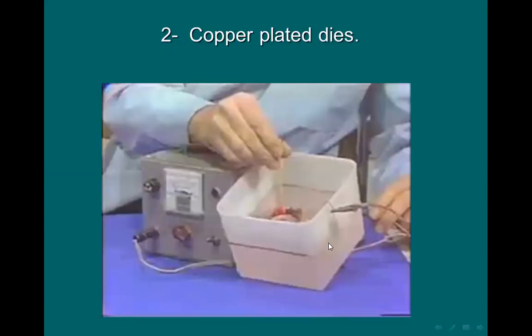This is the electrical cell, the electrolyte cell, where we are going to put the impression inside it, and then we fill the cell with the required material to be used as a cover on the cast.